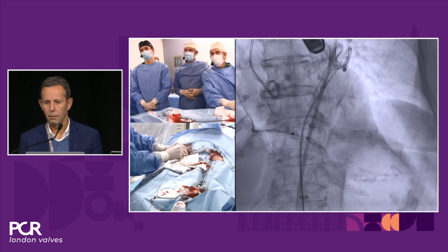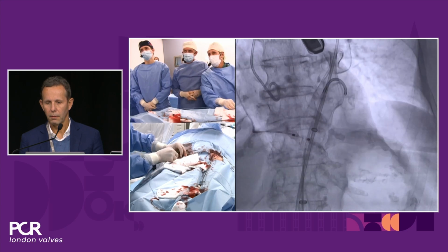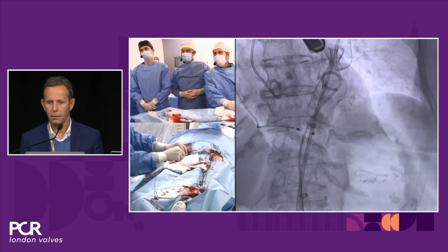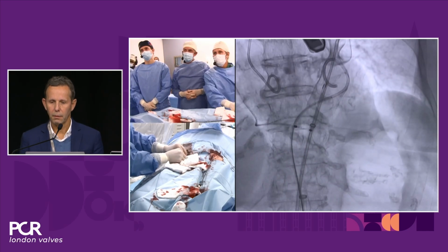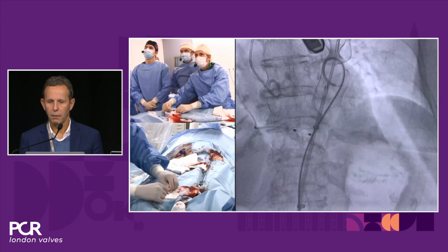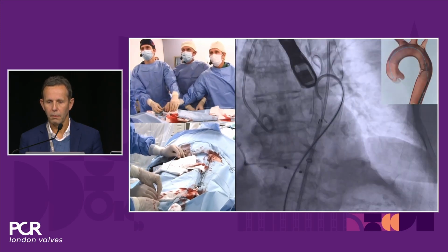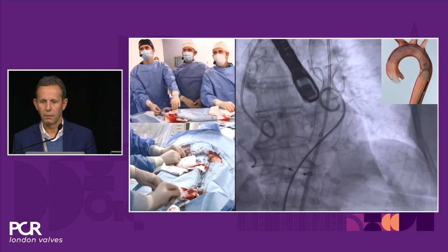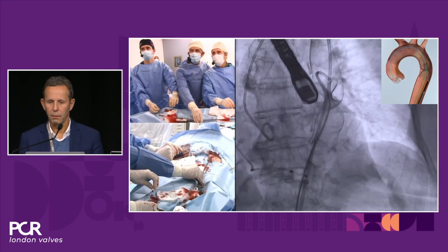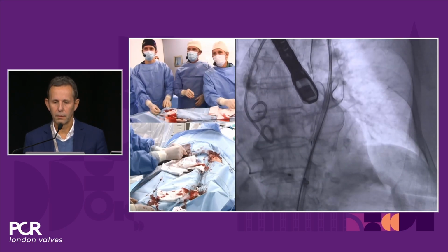And here I think we're at the side, right? Yes. You're behind. We should do it again. Now we are clearly inside. Let me put a little bit more support here and cross it. And then we do a quick wiggle test just to make sure that we are inside the port and go all the way to the ascending aorta.